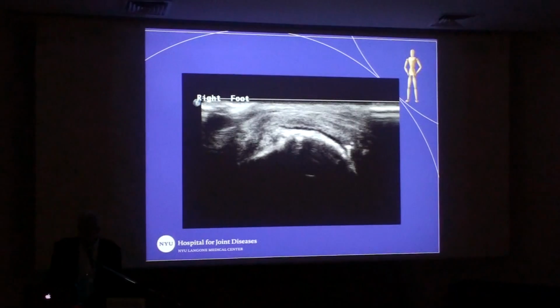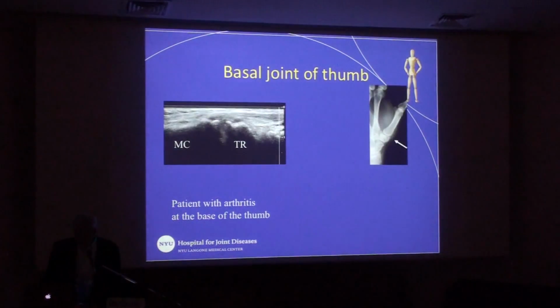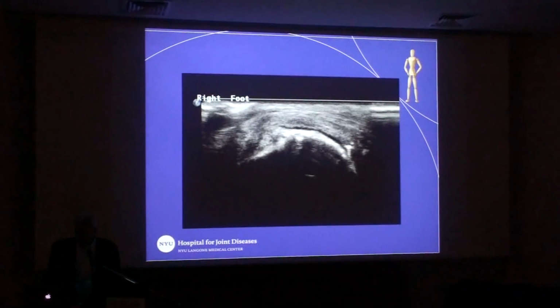And of course, like any other injection, as I said before, we would, oops, let's see if I can do this. There we go. If it works. Maybe.